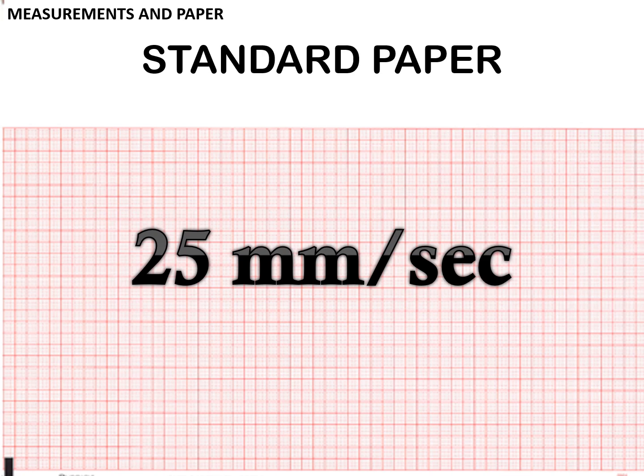The only time you'll see a deviation from this is every now and then, like in the neonatal ICU, if they have a kid in atrial fib or an SVT or something like that, whose heart rate is 300 or more. And sometimes they'll need to do an assessment of that to find out if that heart rate is regular or irregular. And I will tell you right now that everything at 300 beats per minute looks regular to the untrained eye.